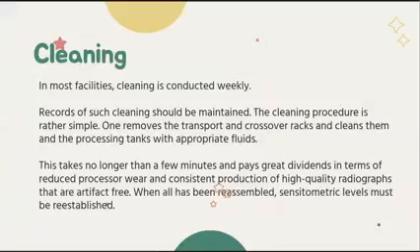So once you remove the transport racks, the crossover racks, they are removable, no? So that it can be properly cleaned. Okay, so it should be cleaned with the appropriate fluids and the appropriate materials. This takes no longer than a few minutes and pays great dividends in terms of reduced processor wear and consistent production of high quality radiographs that are artifact free.